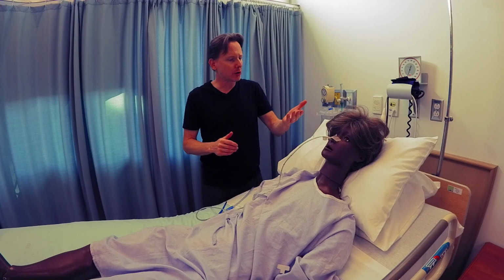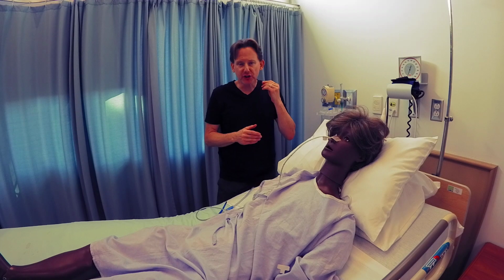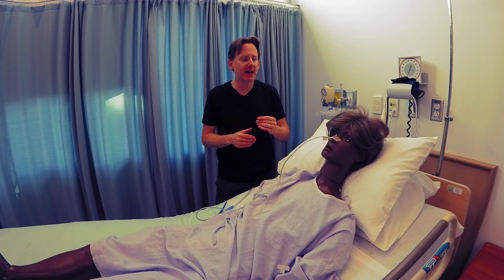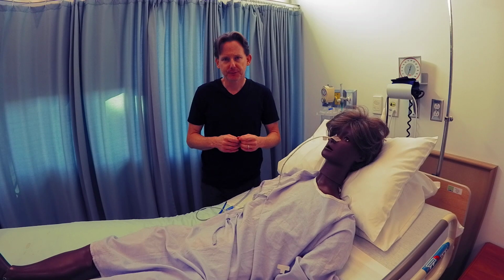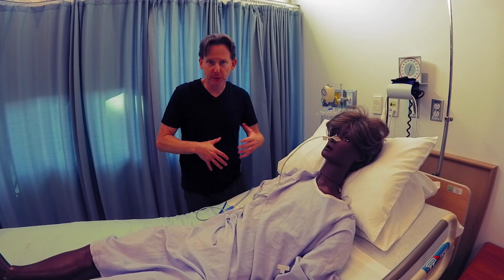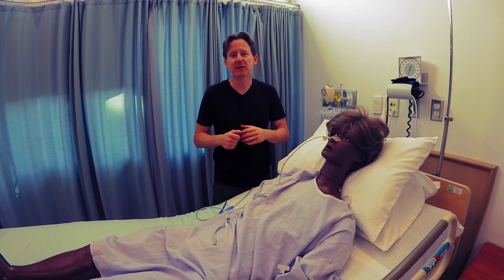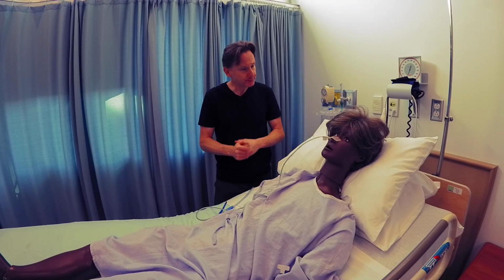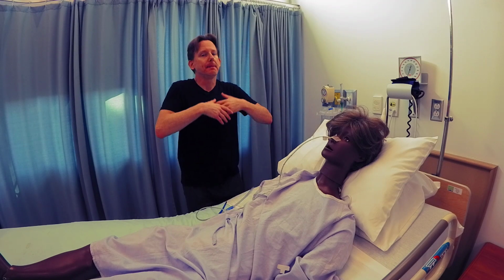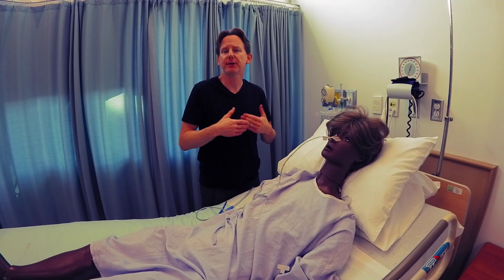And we start, of course, by asking the patient how they feel, because one of the chief symptoms associated with an NG tube insertion is nausea due to gas and fluid building up in the stomach, and typically on a general surgical unit it's associated with some kind of ileus, a bowel ileus. So we ask the patient how they're doing. They say they're nauseated or they say they're fine. Hopefully with the NG in situ they're saying they feel fine.